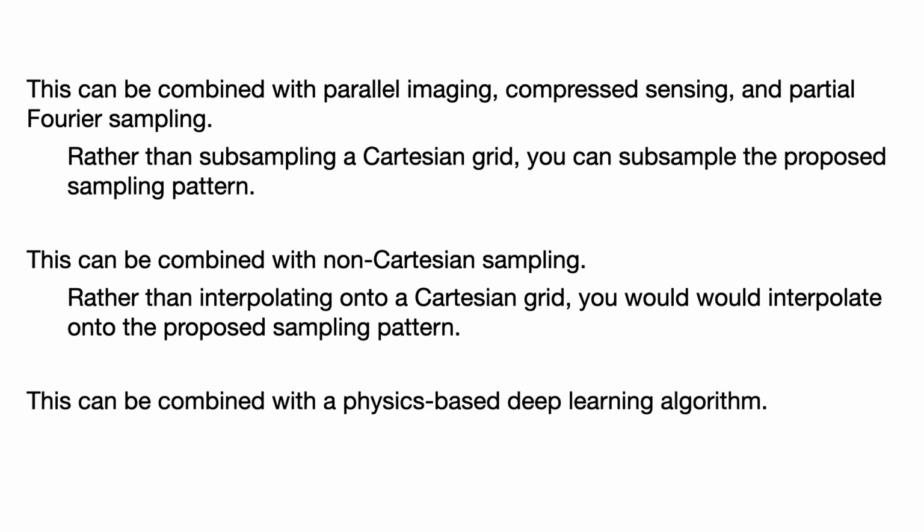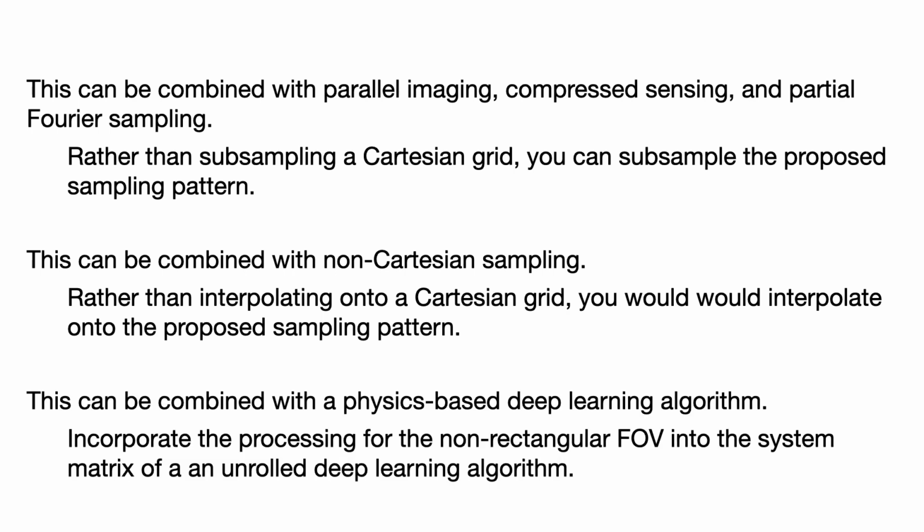And finally, this can be combined with a physics-based deep learning algorithm, where you would incorporate the processing for the non-rectangular field of view into the system matrix of an unrolled deep learning algorithm. A final note, we have applied for a patent on this technology, and thank you for your attention.